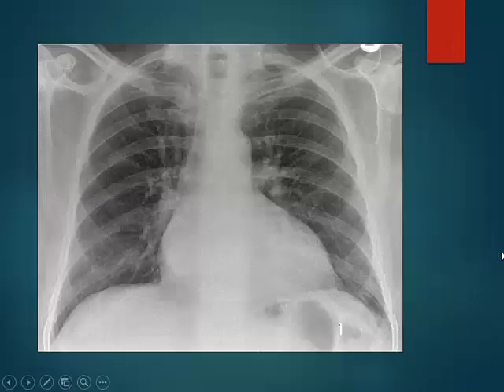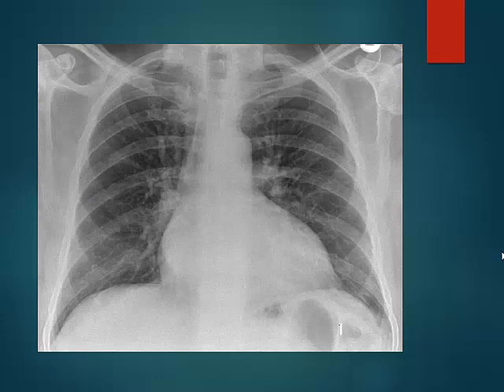Now coming to a very common X-ray presenting in adult cardiology clinics, this one here. So if you want to go through the findings here, let's start with heart size. What do you think about the heart size here? Is it normal or is it large? It's large, okay? Everybody agrees with that.